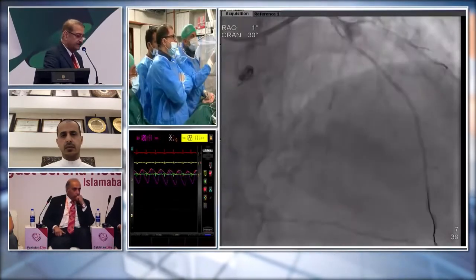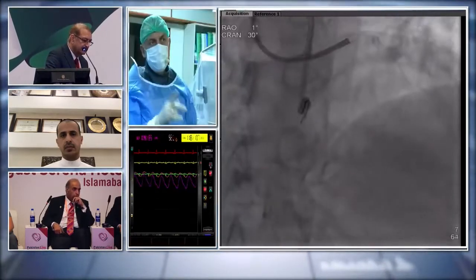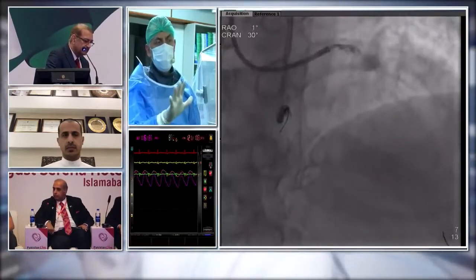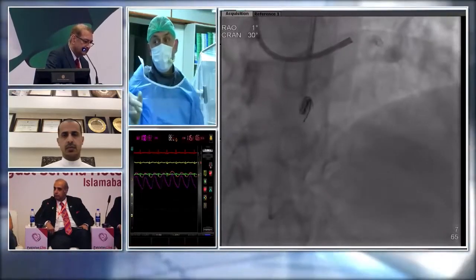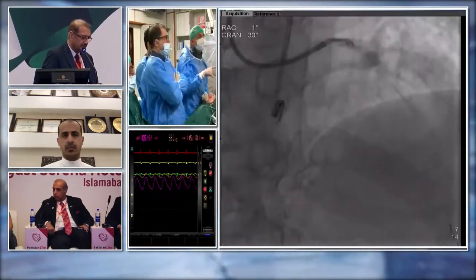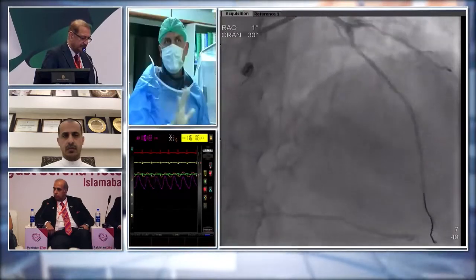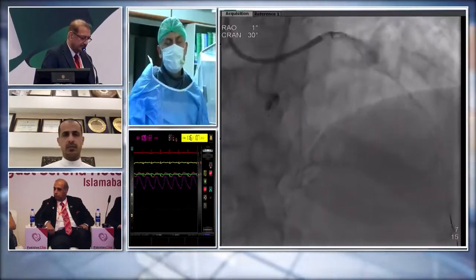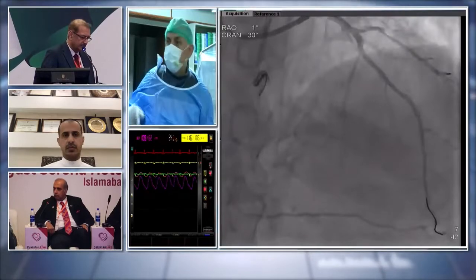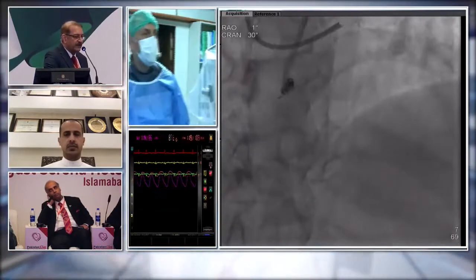All right. Even if we have left main disease, I would do first RCA and then the same session left main. But for left main, I definitely need IVUS. If I go retrograde, then in that case I would do the left main first. But we have a good chance for antegrade recanalization. Let's do antegrade CTO. We have wire pressure, everything is fine, we have a wire in place. It's not that tight a lesion, I would say. We will see by IVUS. I'd like to show you that. Can we prepare IVUS meanwhile, yes, please? Let's focus on RCA first, and then we will do left main work.